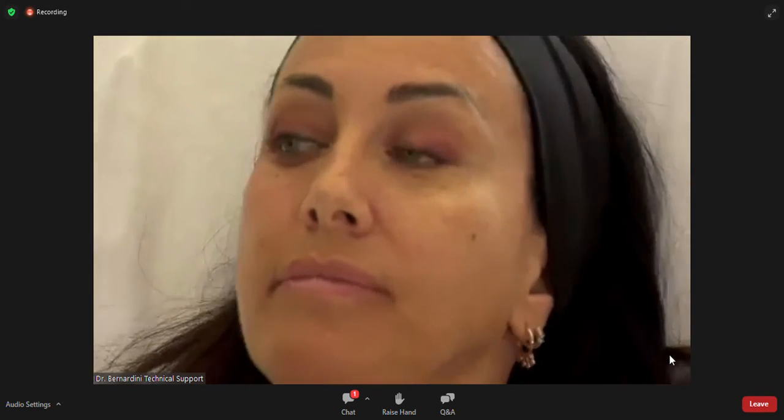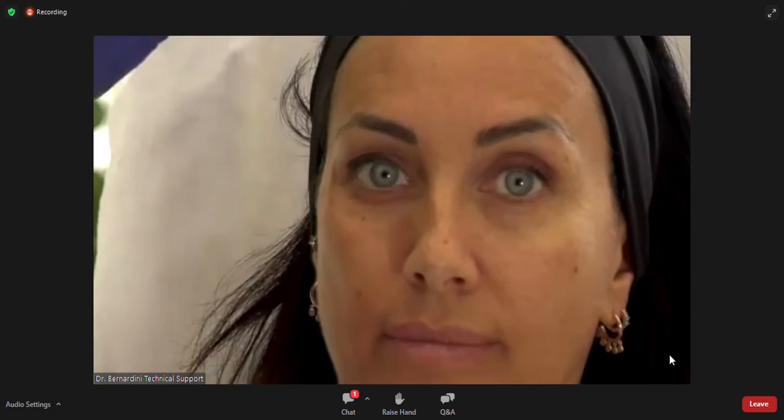Okay, so for me, this is the first thing I do. I'm going to tell the patient, senza sorridere, guardati bene. Now what I ask you to do as a camera, and Serena, can you, okay, just perfect. Okay, straight into the camera.